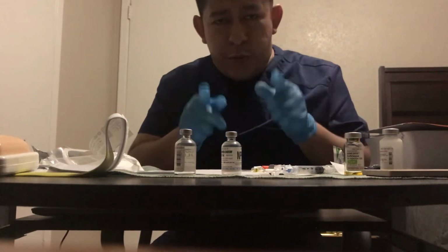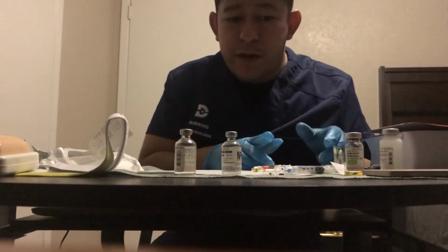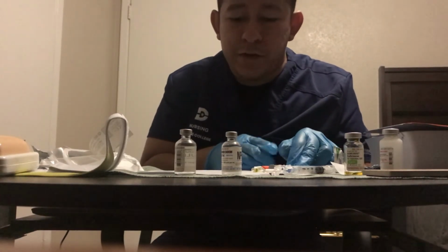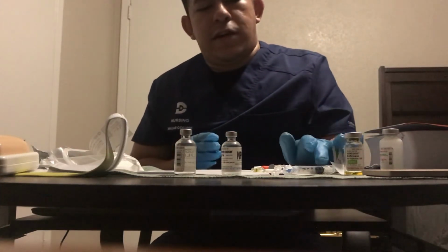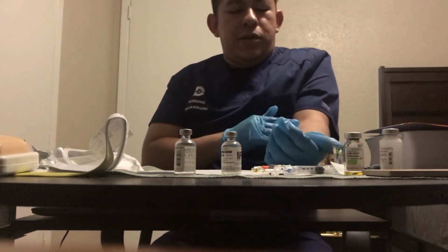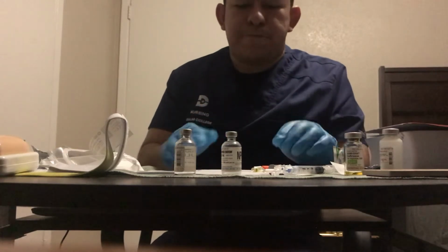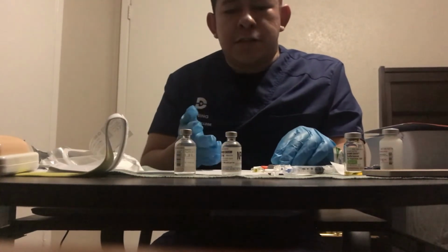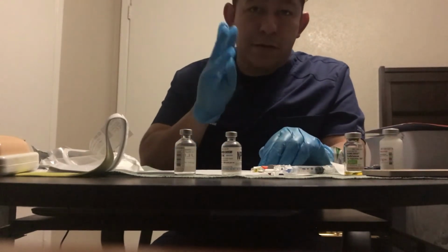And it's important because you want to make sure that that breakfast tray is in the room when you're going to give the insulin. If not, don't give it because you don't know if they're going to eat. So lastly, I also have this tuberculin or PPD that I'm going to give you, and it's simply done to see if you have been exposed to TB. Any questions? If it doesn't have any questions, then I will proceed to do my third check.